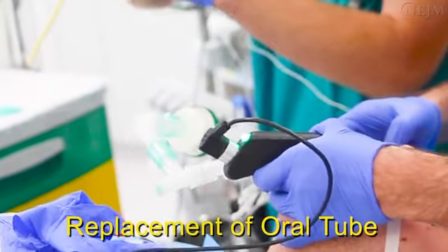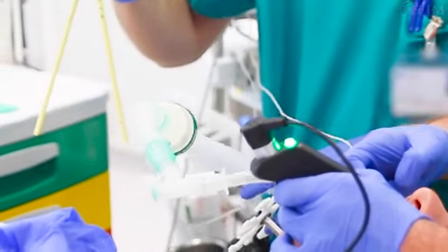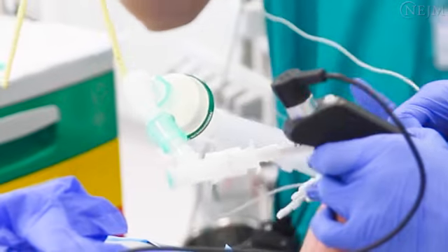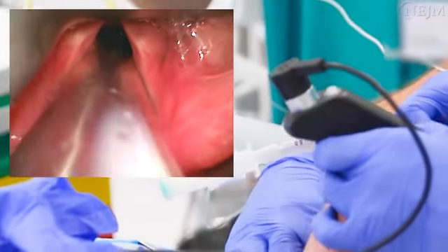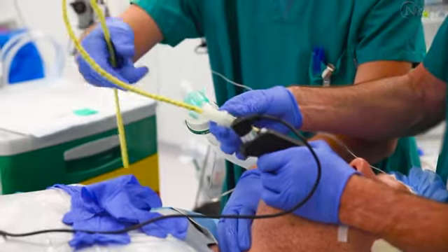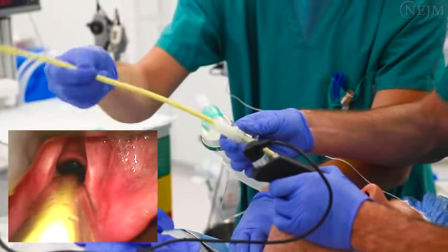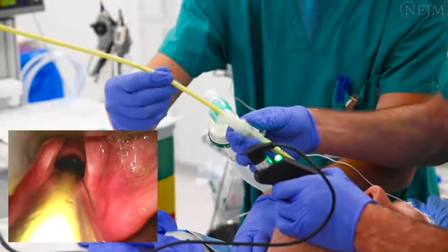To replace an oral tube with a new oral tube, begin by inserting the video laryngoscope alongside the currently placed tube until it reaches a point that will provide visualization of the tube exchange procedure in the glottic region. Next, advance the lubricated airway exchange catheter through the previously attached adapter until it reaches the determined mark. You should not encounter any resistance.